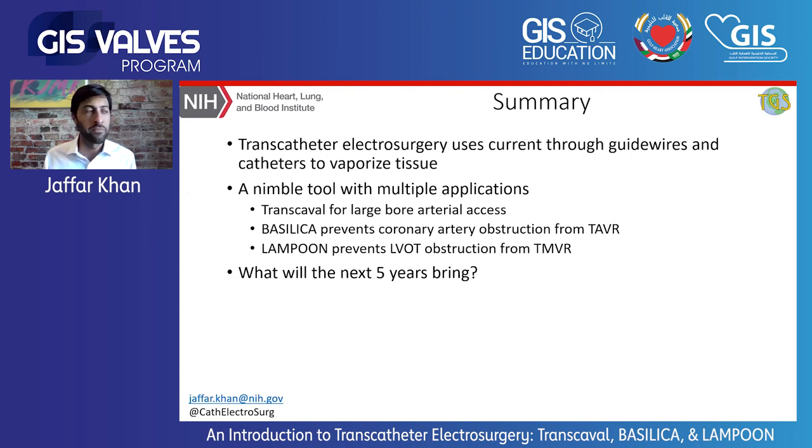And to close off the talk in the session, I really want to be provocative in saying this is a tool that you can use and make bespoke treatments for your patients. Many of these procedures were invented in the last 5 years using transcatheter electrosurgery. So really think what you can perform for your patients and what we as a field can invent using this technology in the next 5 years. I think this is a really exciting field, and I look forward to being part of it in the future.